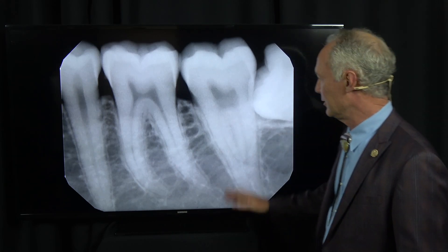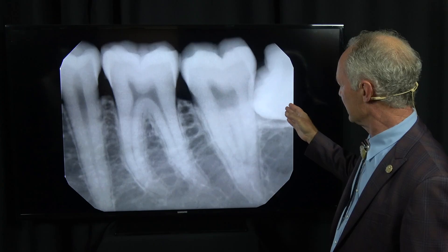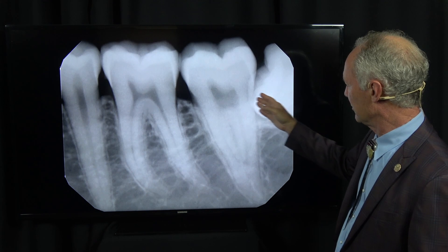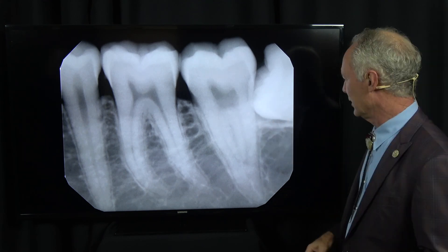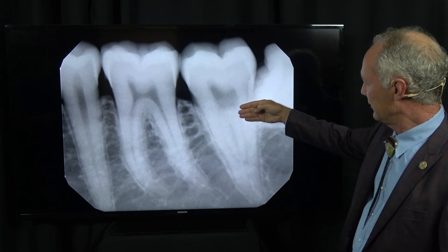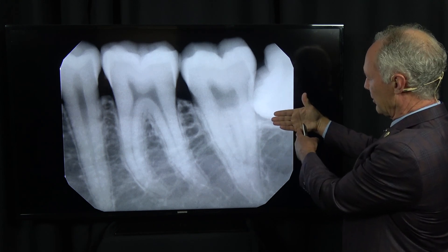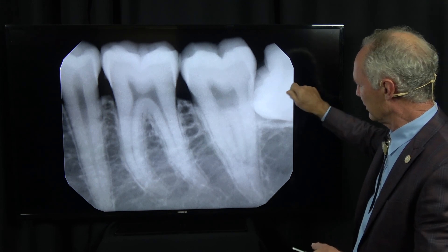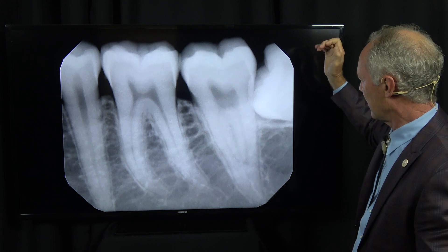Let's talk about surgical extraction of an impacted mandibular wisdom tooth. You can see this is not quite a horizontal impaction, but almost. In a perfect world, if it's a horizontal impaction, you cut the coronal part of the tooth off and then move it forward — move the roots forward and take them out in a second part.